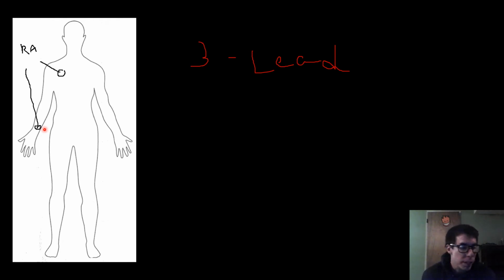That just gives a more accurate picture. However, if you recall me saying, that does make it more sensitive. Because it's more accurate, more sensitive, that means that little movements will cause artifact, which we're going to discuss later in this video, but it makes it harder to get a clean picture. It's just more accurate when you do get it that way.